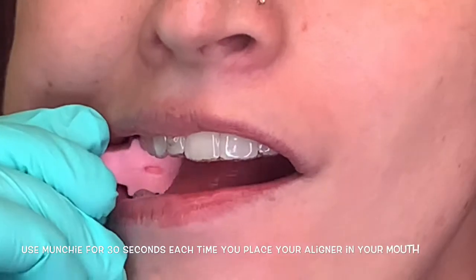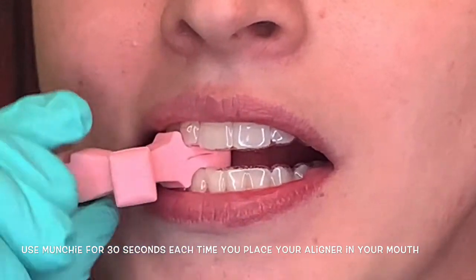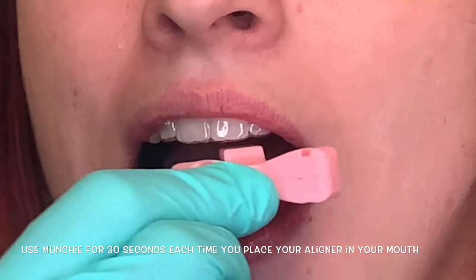Every time you put your aligners in, you're gonna want to seat your aligners for 30 seconds, walking from one side all the way to the other side of your mouth.